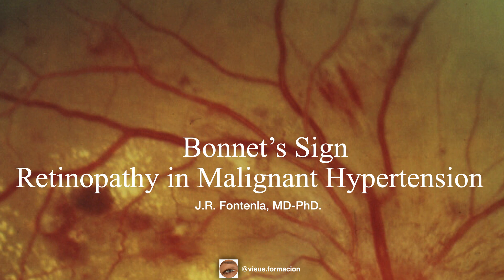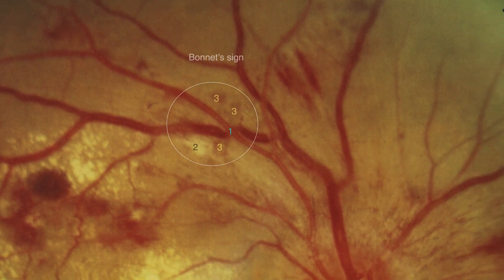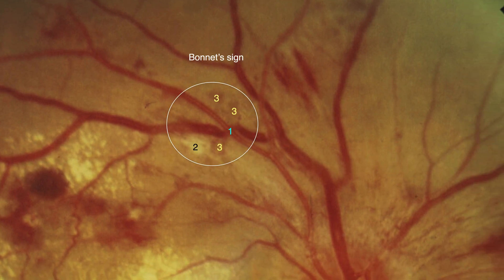In this video we are going to describe the bonnet sign, a sign that is associated with retinopathy of malignant arterial hypertension. You can see bonnet sign here, inside the circle, and it is made up of the following triad.